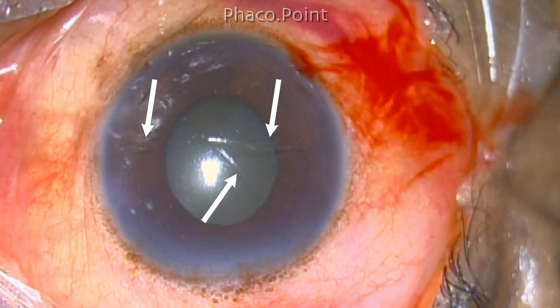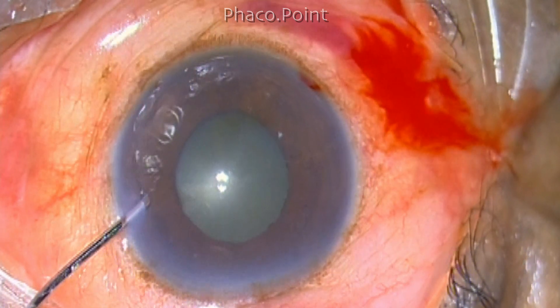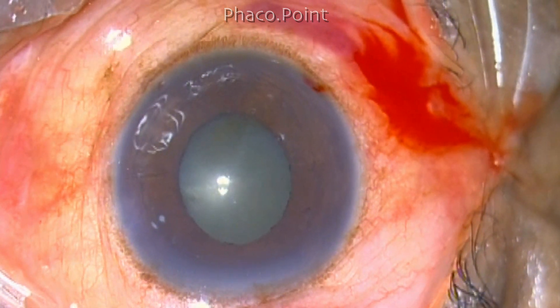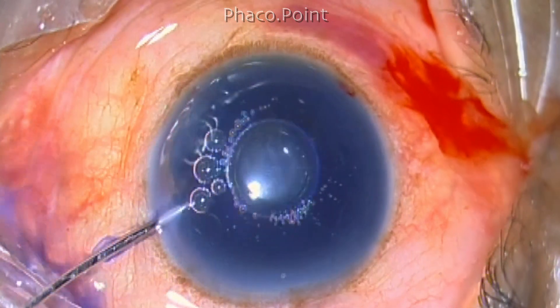These are the toric marks that have been made under the slit lamp using a hockey stick blade. A little more supplementation of lignocaine is given intracamerally because I intend to put the pupil dilating devices as well, and then the anterior capsule is stained with trypan blue.